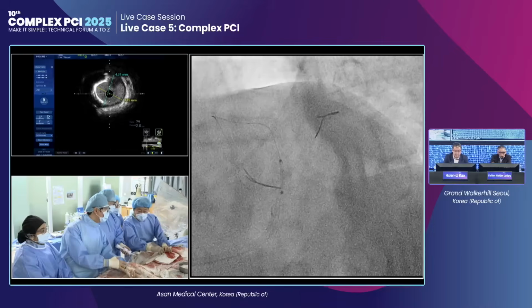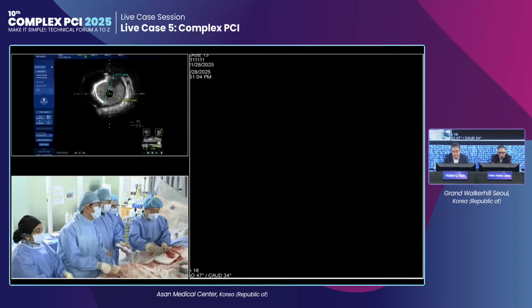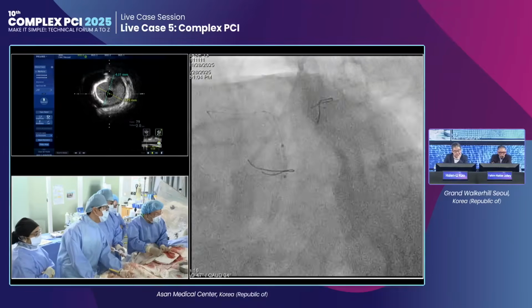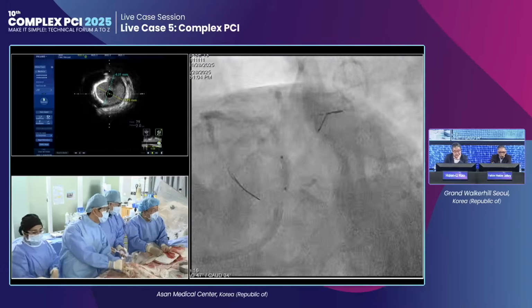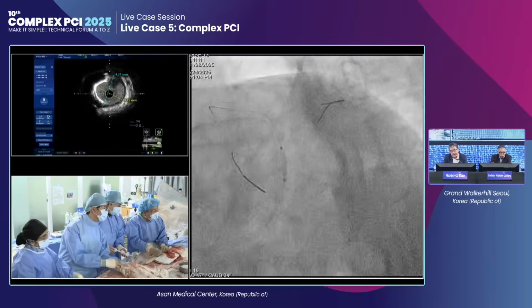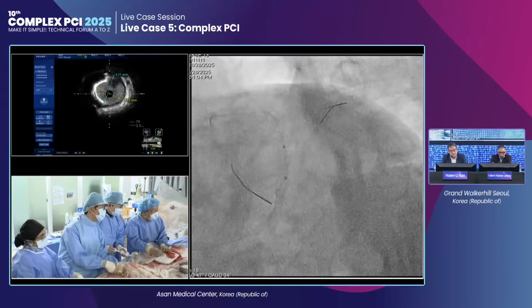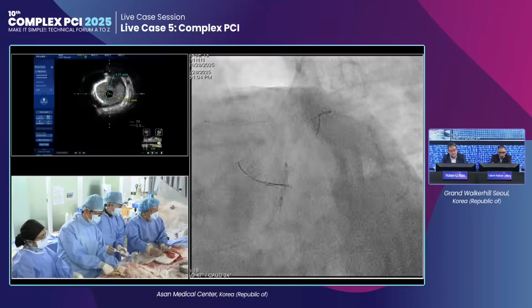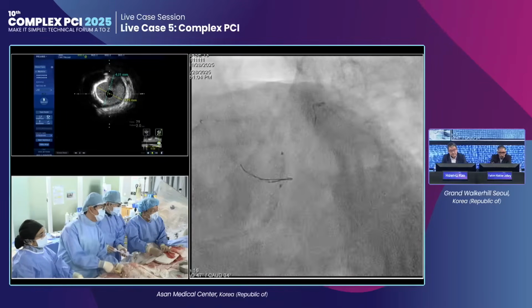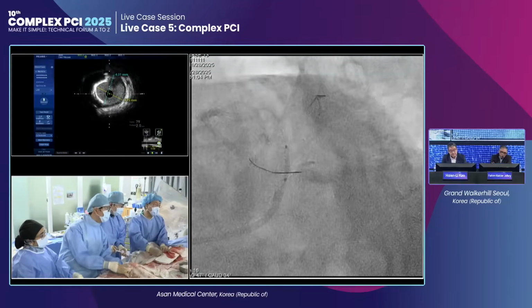Okay, take a picture here. So one more, full injection. What do you think? Maybe a little bit more back. Which stent is this? It's the Science Zions stent. Zions has the advantage that mostly the stent edge is on the balloon marker. The marker will tell you exactly the beginning of the stent. I think it looks pretty okay.